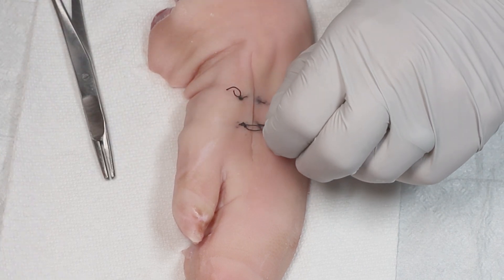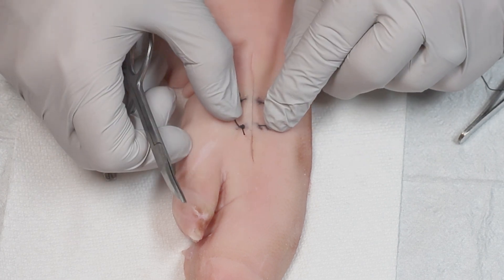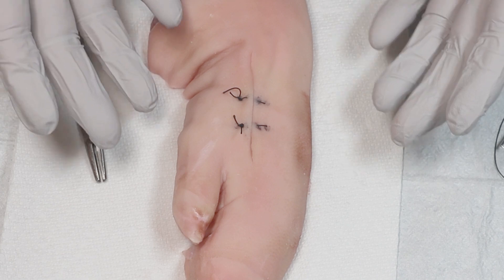In contrast to this suture, a simple interrupted suture would depend on a very small area to keep the wound together — this gives a lot more strength to the closure and everts the skin edges very nicely. The vertical mattress stitch gives you stronger deep and superficial wound closure than a simple interrupted or running suture, and gives you good edge eversion and alignment. It is, unfortunately, somewhat time consuming, so it's not often used by busy surgeons. The control it requires also means this suture is somewhat unforgiving if you fail to align the edges vertically. This type of stitch is also prone to dig into skin and is more likely than other suture types to leave small scars along the main wound, making it less useful in areas where the appearance of the scar matters, like the face.